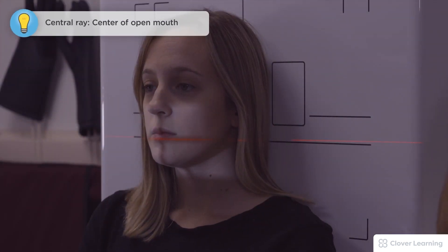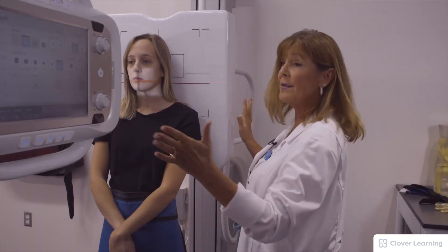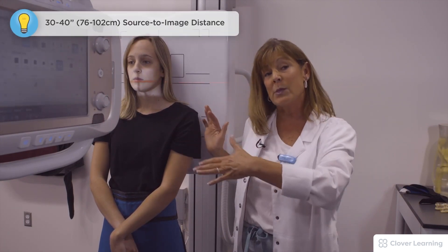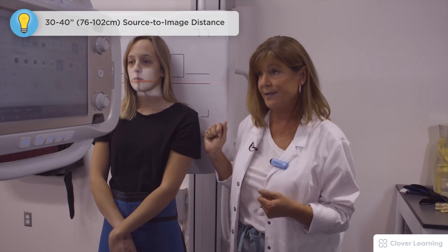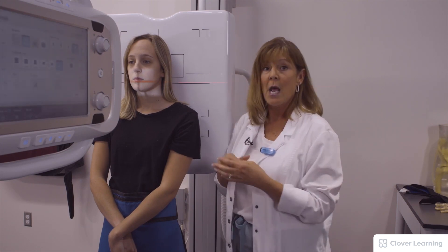This view is of the dens or the odontoid. If you do not open the mouth, the teeth or the base of the skull will be in the way. Right now I have my central ray at the closed lips. The central ray is actually at the open mouth, but it's an uncomfortable position, so I'll do that last. My SID is between 30 and 40 inches.